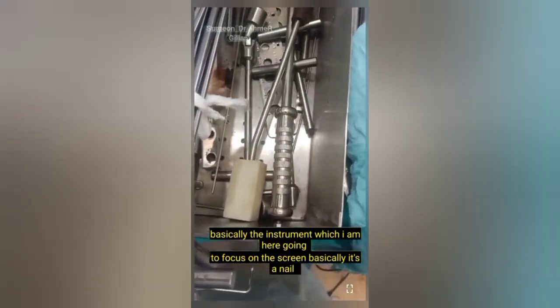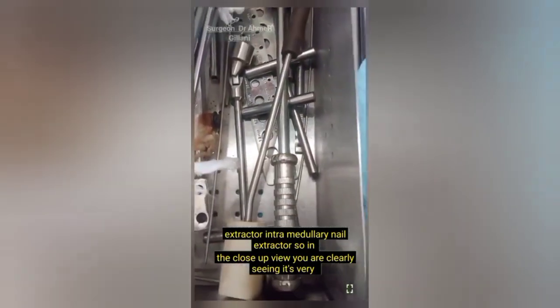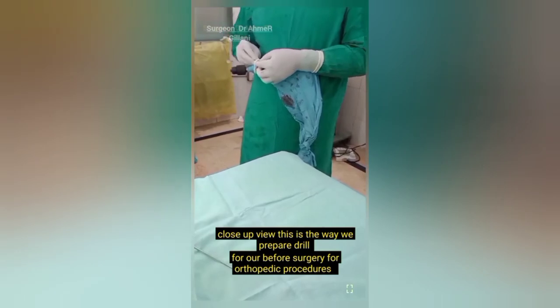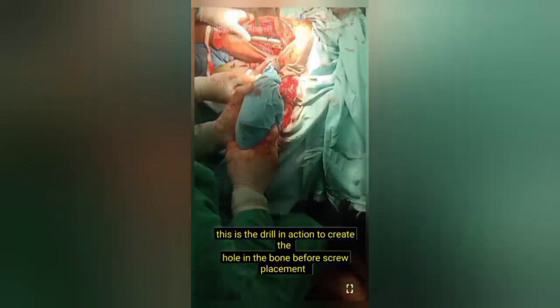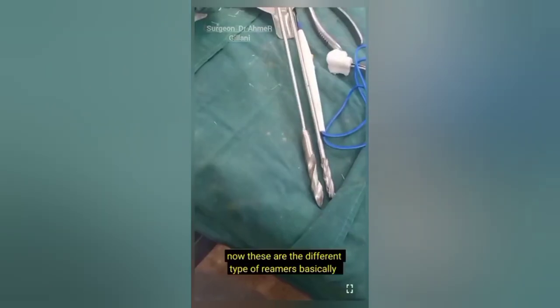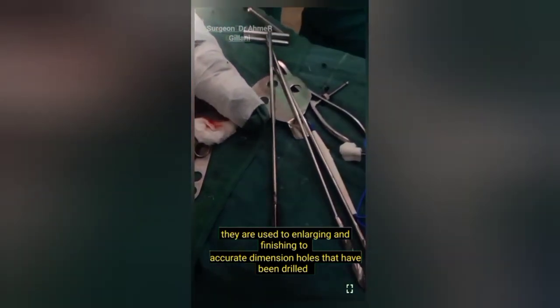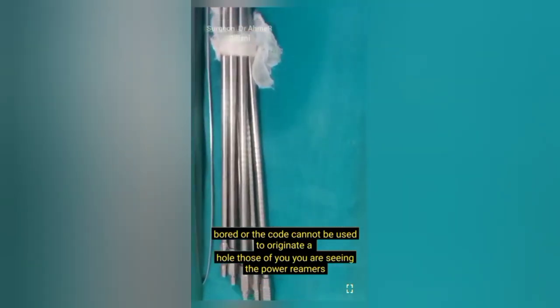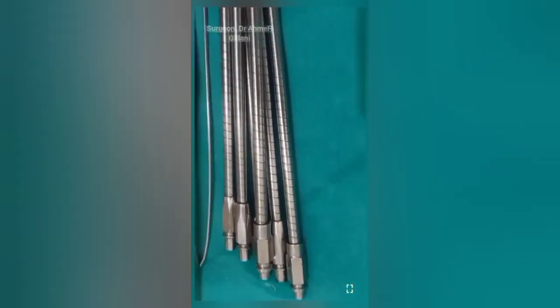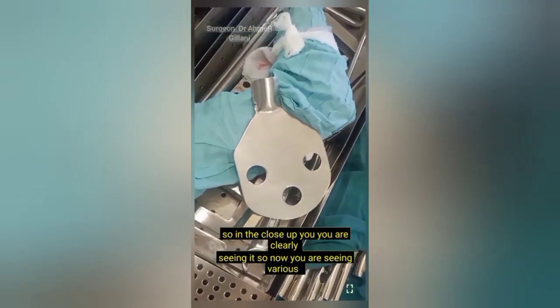The next instrument to be focused on screen is the intramedullary nail extractor. In close-up view you can clearly see it. This is how a drill is prepared before orthopedic surgery, and the drill in action creates a hole in the bone before screw placement. Next are the different types of reamers, basically used for enlarging and finishing to exact-dimension holes that have been drilled — they cannot be used to originate a hole. In close-up view you are seeing the power reamers.